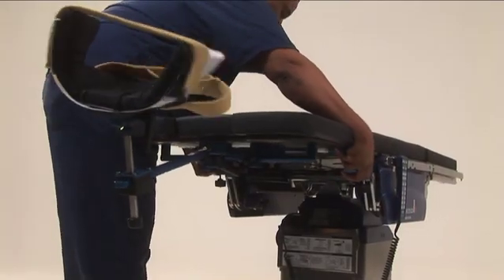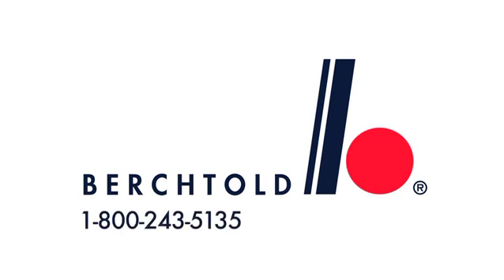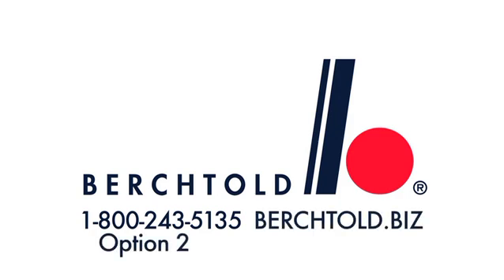Depress the safety latch and then remove the chair from the spars. For more information about the integrated shoulder chair accessory for the D850 and D820, or to order replacement parts, please contact Berktold Technical Support at 1-800-243-5135 option 2, or visit us at berktold.biz.